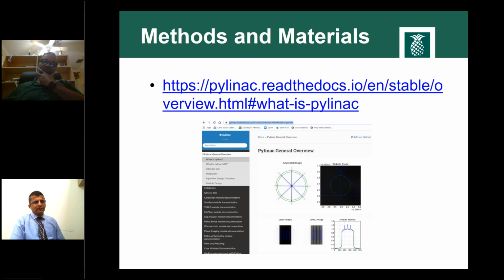As of now, we are using RIT, radiation imaging technology, RIT software, which we will use for identifying the radiation isocenter and stuff like that. So they have built-in software where we use EPID based for our monthly QA and daily QA. All our images are coming through the EPID in DICOM format, and then we export it to that software and we use the analysis method.